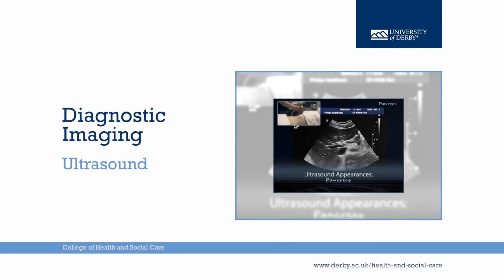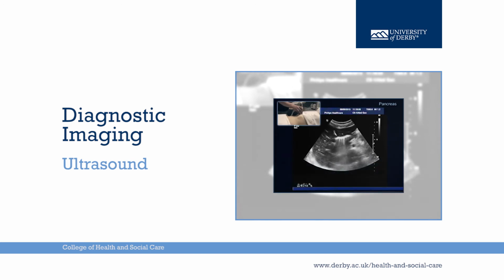Imaging technique of the pancreas. With the transducer in the transverse subxiphoid position, the transducer position is adjusted with slight caudal and cranial tilt until the pancreas comes into view.